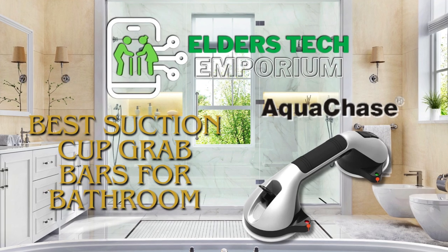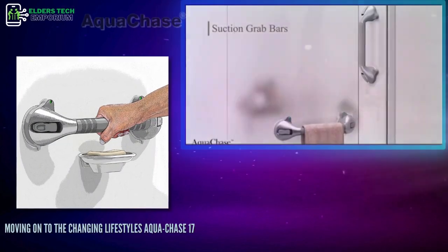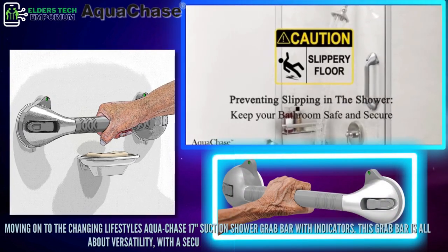Hello everyone! Welcome back to Elders Tech Emporium. Moving on to the Changing Lifestyles AquaChase 17-inch Suction Shower Grab Bar with indicators.